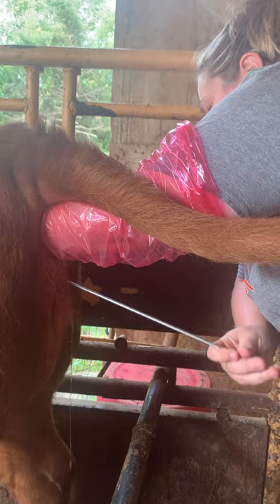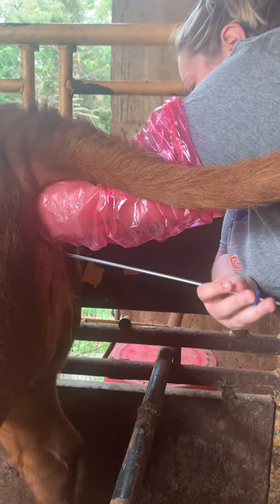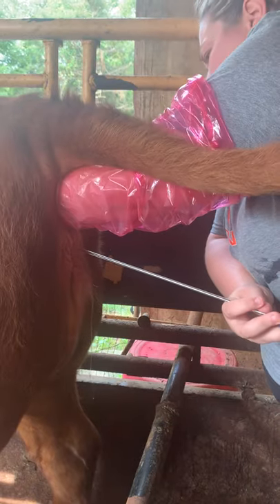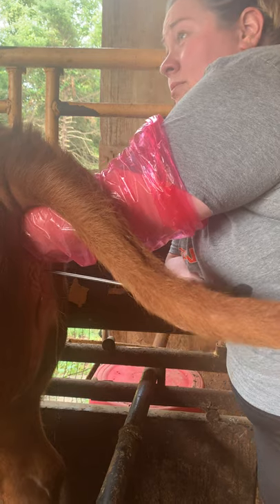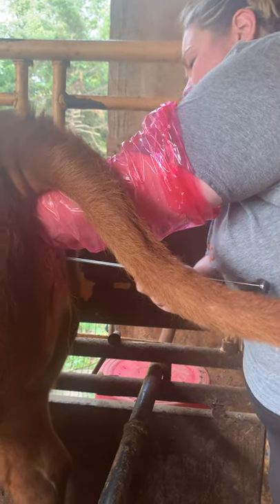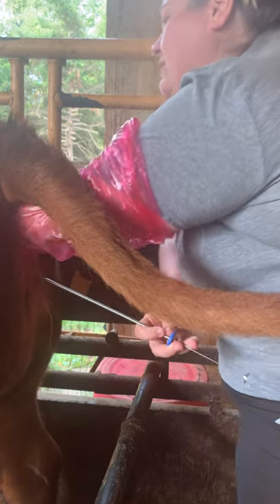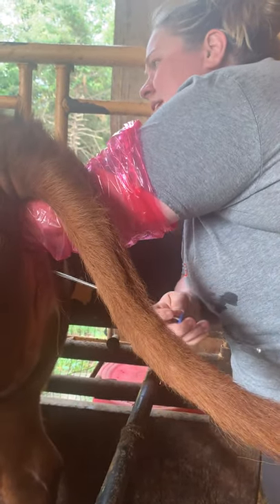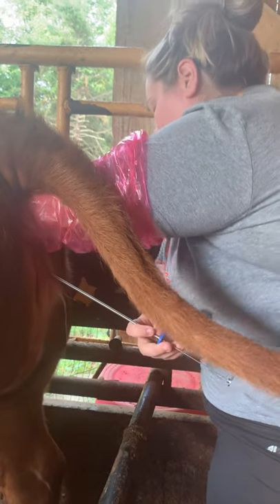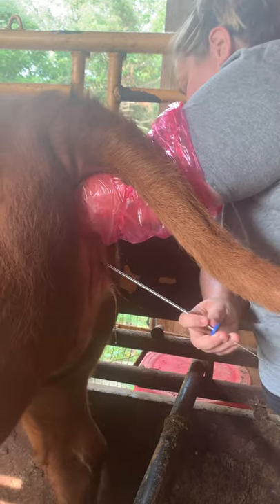I'm going to find the cervix with my rod, and this part always tends to take me forever, just to be honest. I know what I'm doing, however I don't do a bunch at a time where I can just go in and boom — right there. You have to get through some vaginal folds to find the cervix, and once I find my cervix I'm going to deposit the semen. Hopefully we'll check her in about 30 days to see if she's bred, and that'll be it.